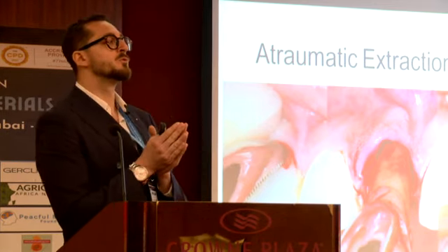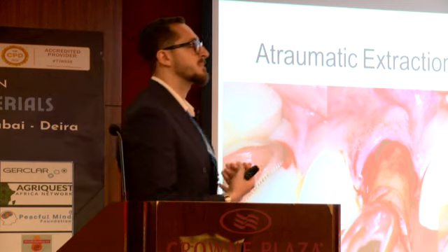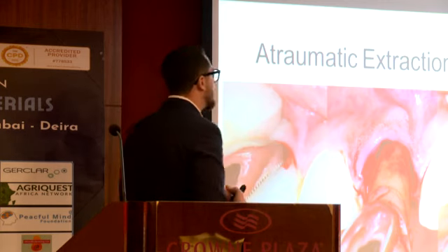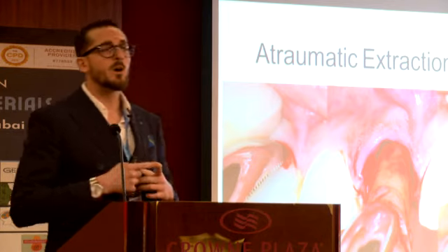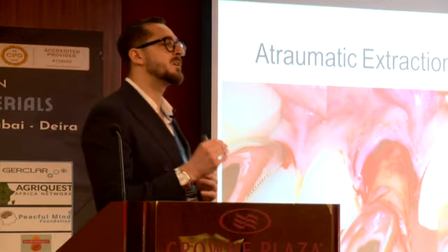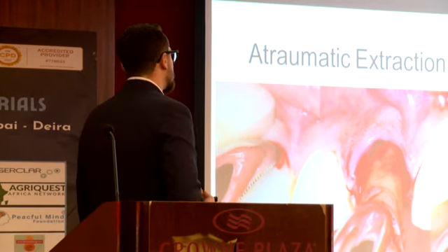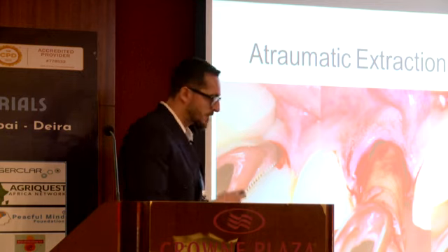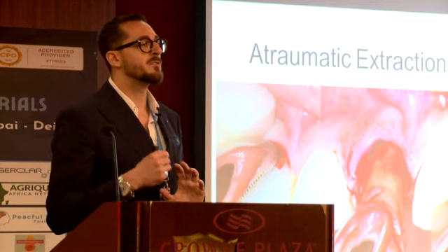I don't have to cause any damage to either soft or hard tissue, because I can basically fail in this step. Personally, I don't like the use of elevators, because in the proximal space they will always damage the soft tissue, the papilla, and cause retraction of the papilla. So I use my left fingers with the forceps, and I just try to do it very, very slowly.